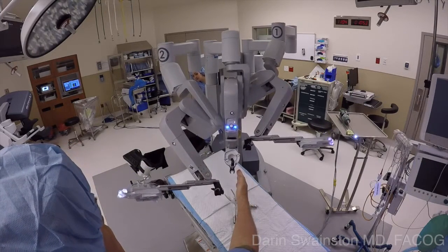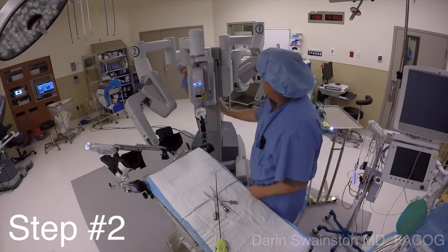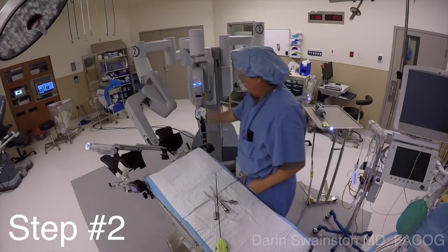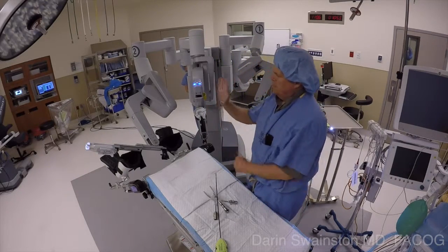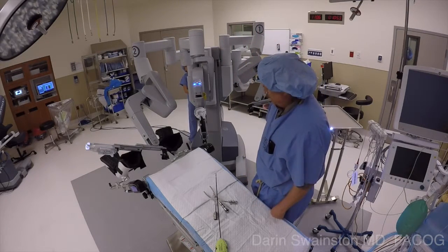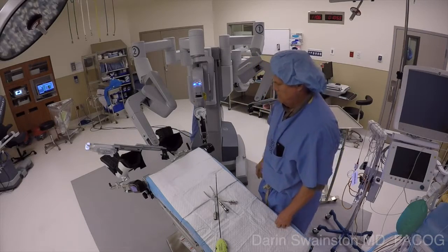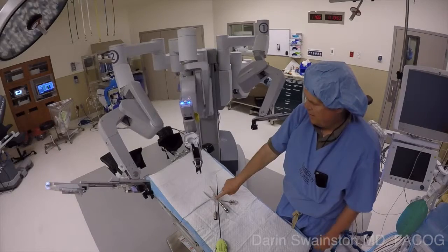Step number two is to pull out the camera arm so that it's all the way out to the sweet spot, lying through the middle of the column with the elbow bent away from the side you're docking. Make sure it's not canted to the right or left — it should be straight up and down, as you see in this example. If you do this as they drive the cart in, they know the right position to take it to.